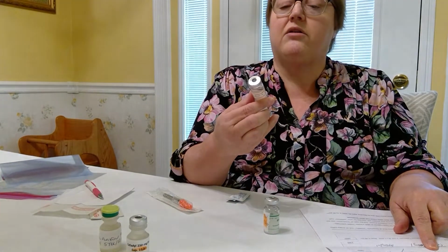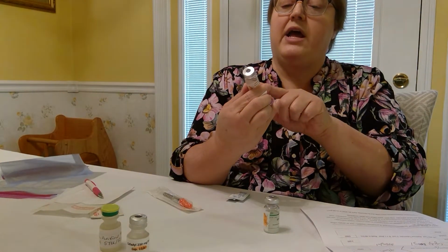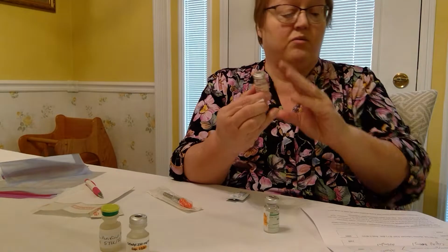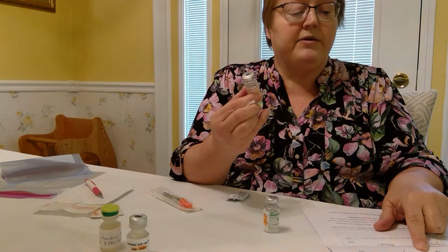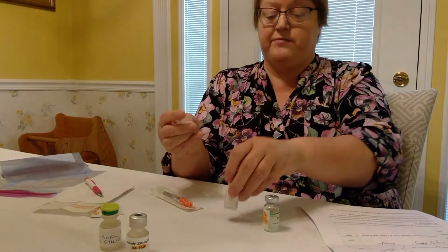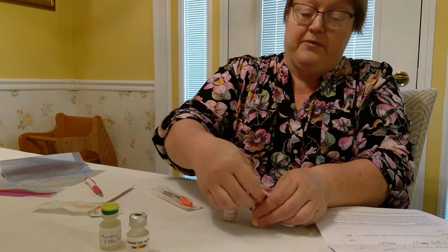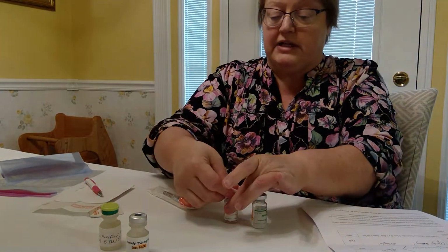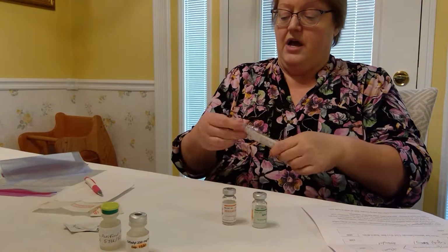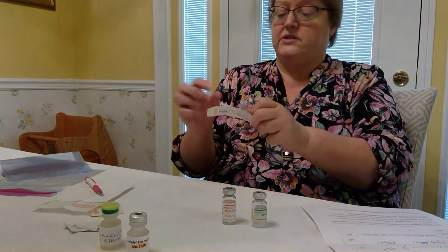Insulin regular. I'm going to give 16 units, and I have 16 units worth here. And I'm going to give it sub-Q at this time to Miss Frozen. So I've checked my rights. I'm going to vigorously rub the tops to clean. Allow that to dry while I open my insulin syringe.